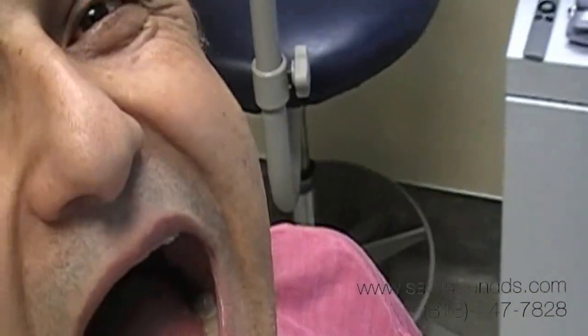Actually, we're trying to remove an extinct technology, which is replacing amalgams. We will be replacing these two on number 12 and 13, and we will be placing CEREC onlays. This is Dr. Hamoui. Hello. And who is this? This is Dr. Sarkissian. And we will be having fun today.